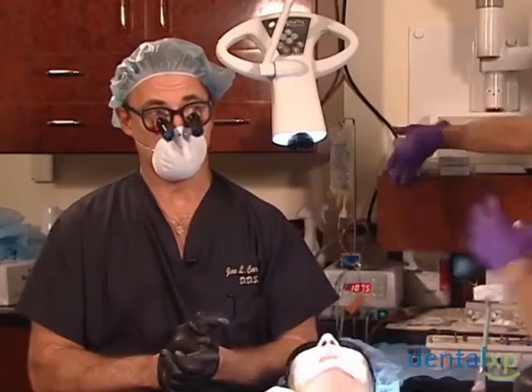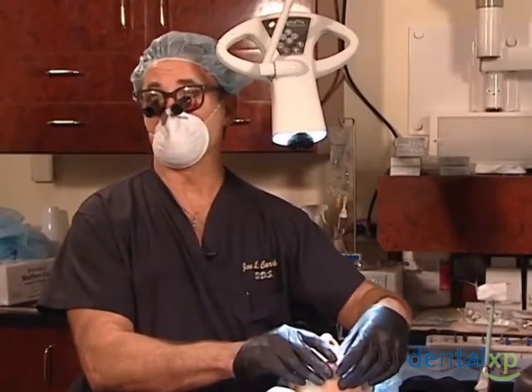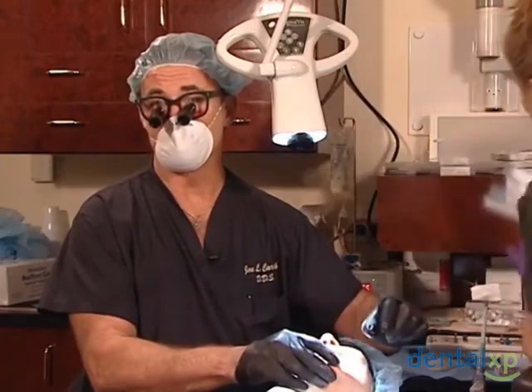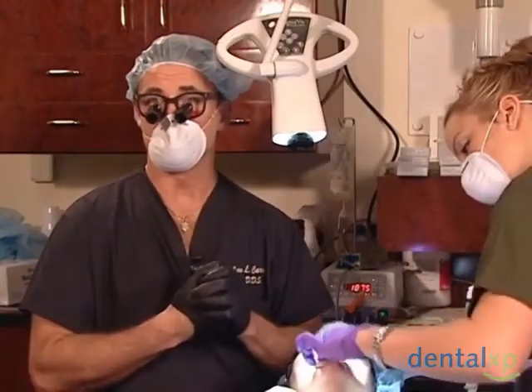Now you say, well, you've just destroyed your stent. That's true, but because you treatment planned this, if you're going to go mesial to the last implant for the osteotomy slightly, then you know you're not going to be in an area of concern. And don't forget, many times you're going to be placing these freehand, and your fingers are going to be your determining factor. What does that mean? That means one finger is on the most buccal undercut, and one finger's on the most lingual undercut. And your goal is to not puncture your finger with the burr. So if you're splitting the difference, that's a good way of doing it.